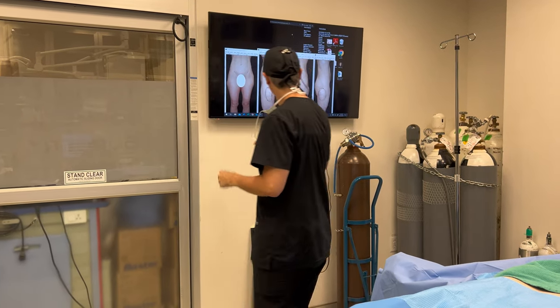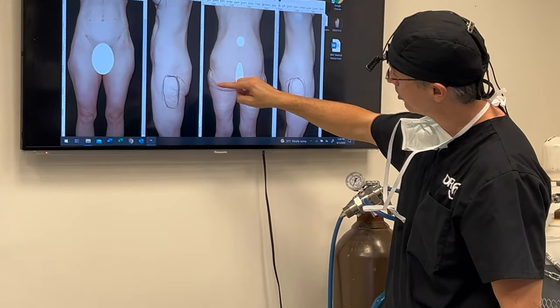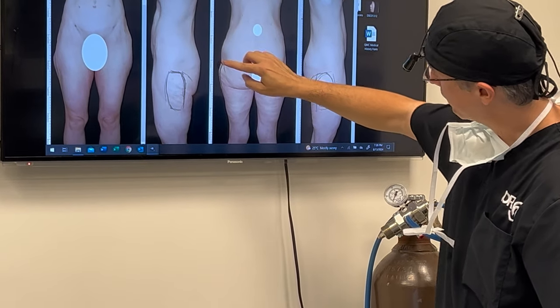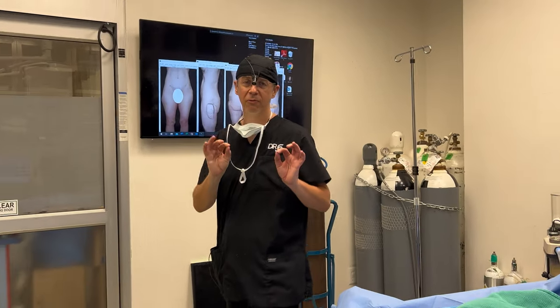When we look here and zoom in, you can see the body gets really, really small. You can see just a little bulge — a little extra fat, not a large volume. Just very, very fine shape correction.